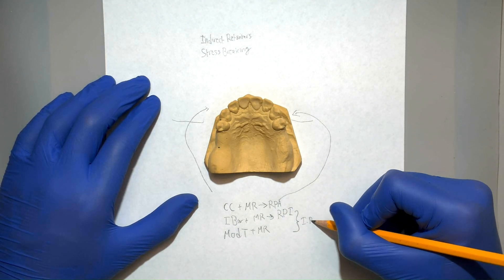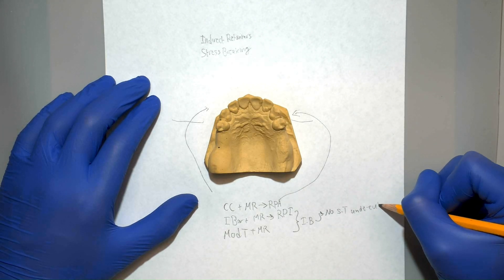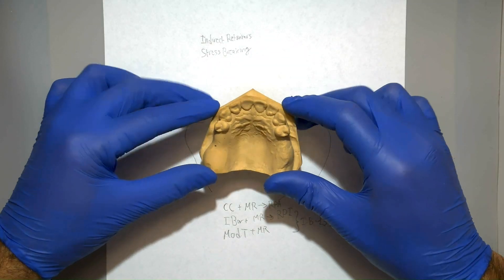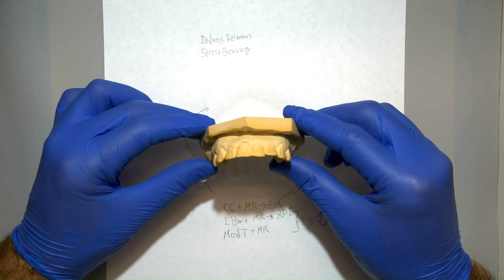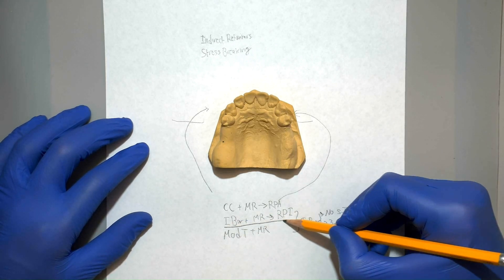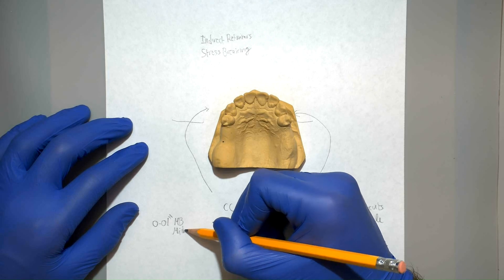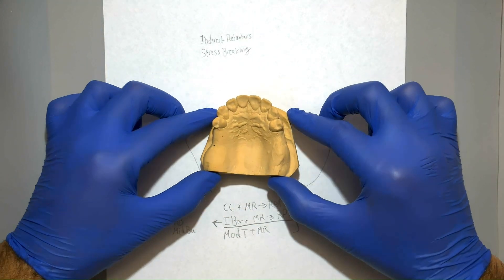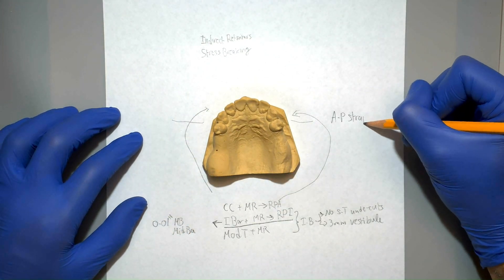Both the I-bar and the modified T-bar are infrabulge clasps, which means they won't be compatible with any soft tissue undercuts or buccal vestibular depth shallower than 3 mm. When evaluating this cast, we notice that there aren't any buccal soft tissue undercuts and there is sufficient buccal vestibular depth, so we'll most likely be going with an I-bar. For that, we'll be looking for a 0.01 inch undercut on the mesial buccal or the mid-buccal surface of the abutment teeth. Additionally, this cast seems to have good support, so we'll probably be using an AP strap for a major connector.